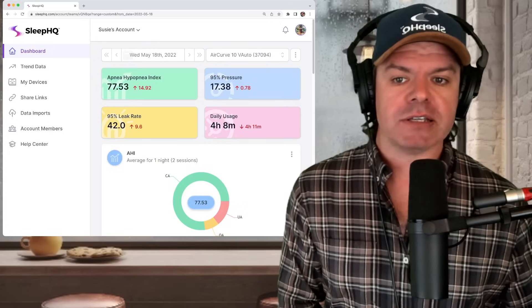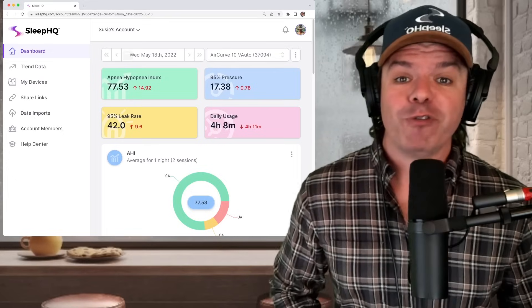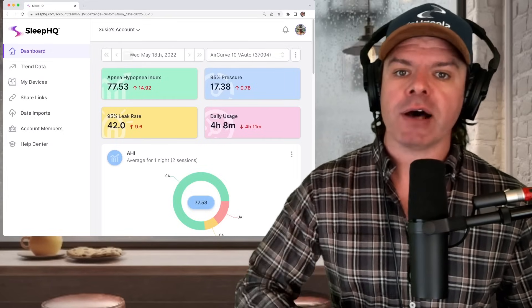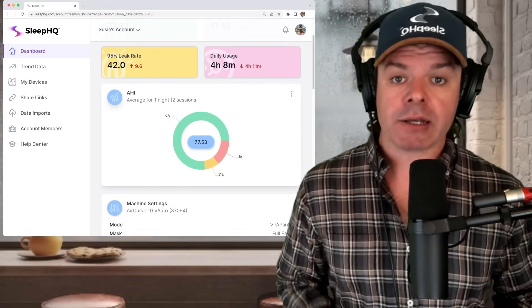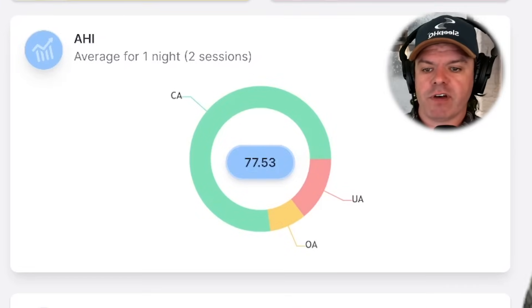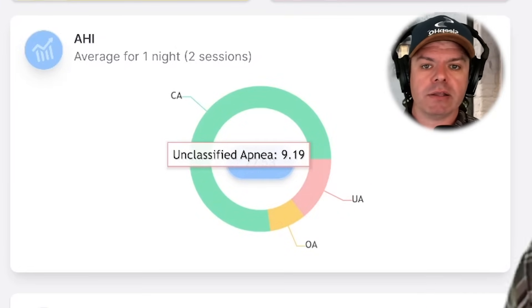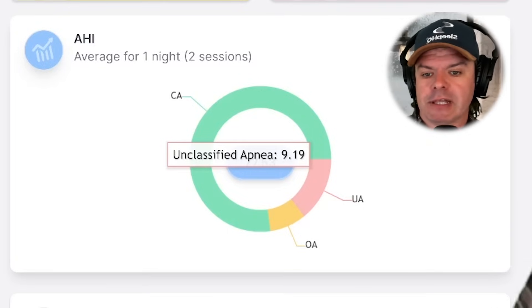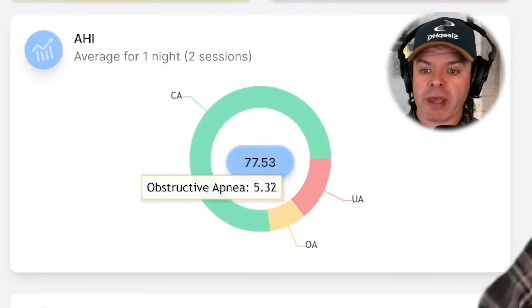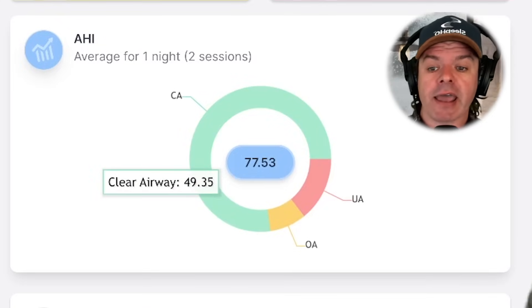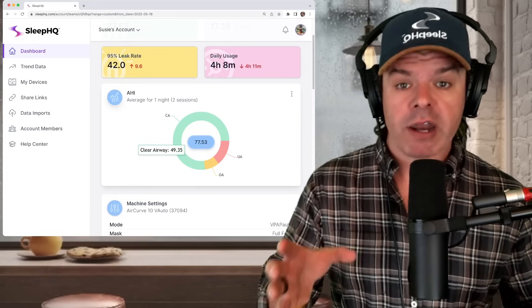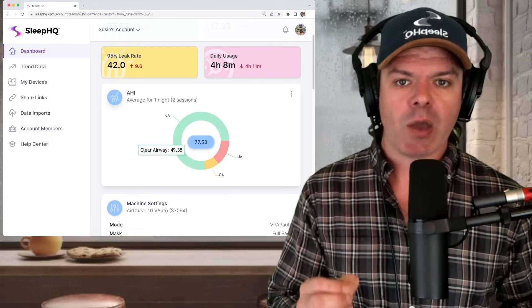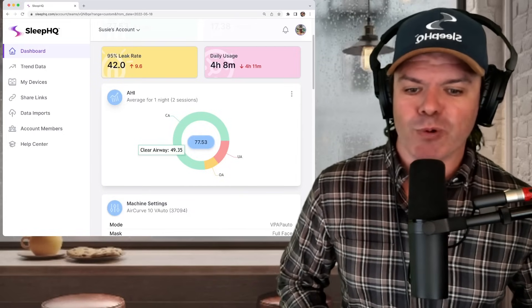Okay, so currently the device is an AirCurve 10 V Auto. So this is a ResMed BiPAP machine. First, let's take a look at the AHI donut. This will give us a good idea as to what classifications of apnea are contributing to that high AHI number. Here it is here. So we have unclassified apnea 9.19. This means the machine couldn't determine what type of apnea it was. Then we have obstructive apnea 5.32, that's only a small amount. And then we have this great big green bar. What's this? Clear airway, 49.35. So we can see right here on the donut, the big problem here is the clear airway events. These are central apnea events.